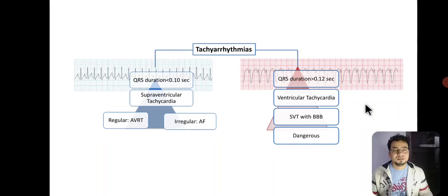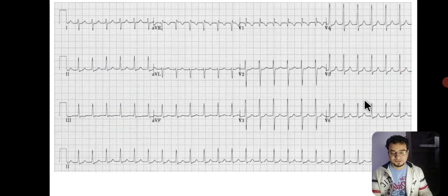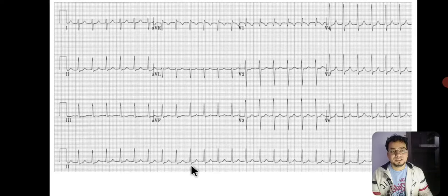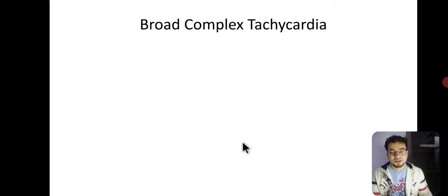Broad complex tachycardias are more dangerous than narrow complex tachycardias. Now look at this ECG — the rhythm is regular, heart rate is 1500 divided by 10 small boxes, giving a rate of 150. P wave is not clearly visible before the QRS complex in lead 2, so it is probably embedded in the QRS. The QRS duration is just one small box, that is 0.04 second, so the diagnosis is narrow complex tachycardia.